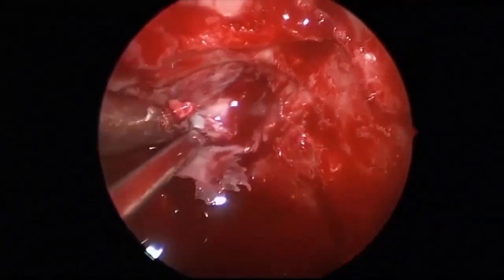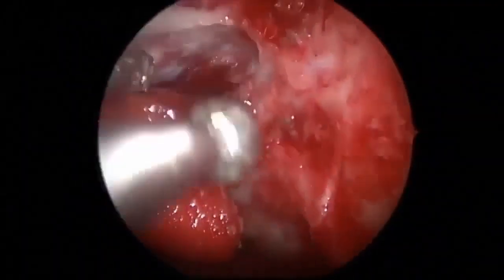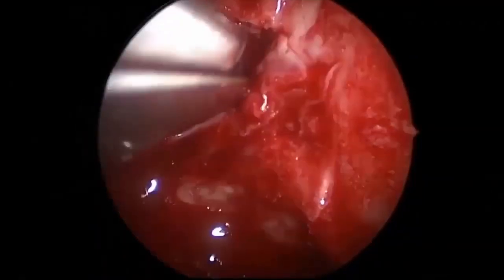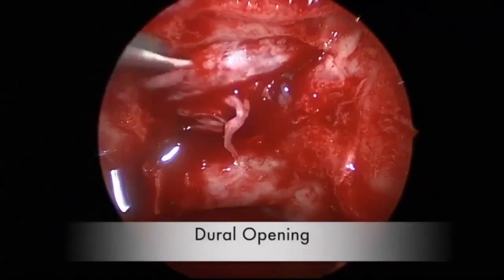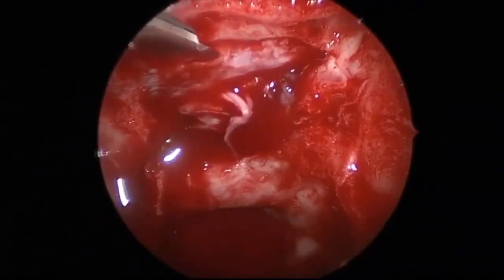The planum is removed with gentle mobilization of the egg-shelled bone. Additional drilling above the optic canal exposes the base of the tumor on either side. Care is taken not to damage the optic nerves within the canal. The dura can then be opened superiorly to expose the base of the tumor.